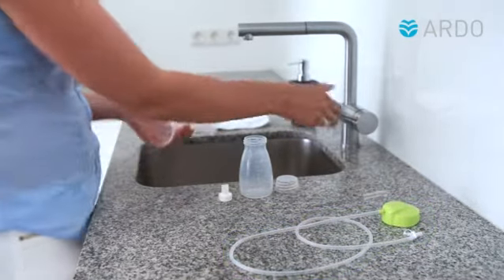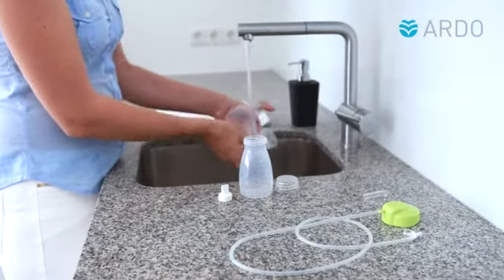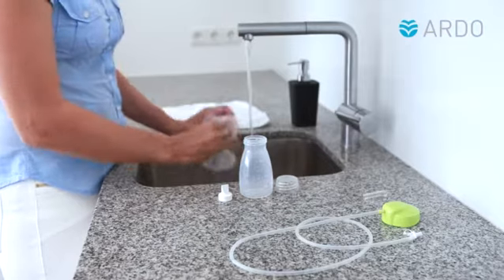These parts can be simply wiped with a damp cloth. First, rinse the breast shell, membrane pot, bottle, and lip valve with cold drinking water.